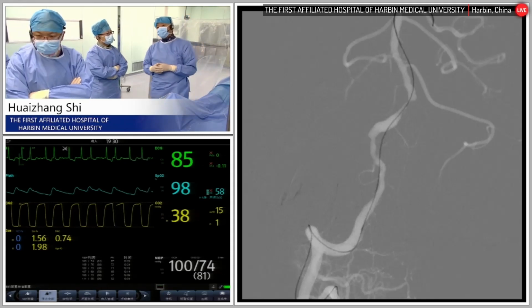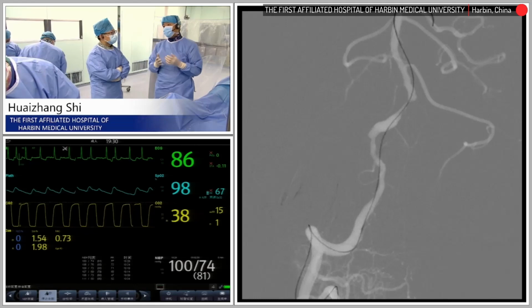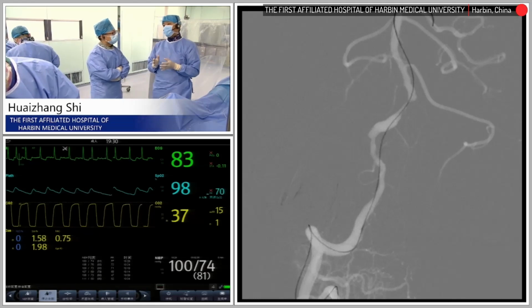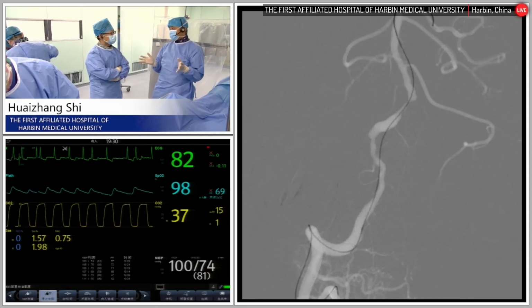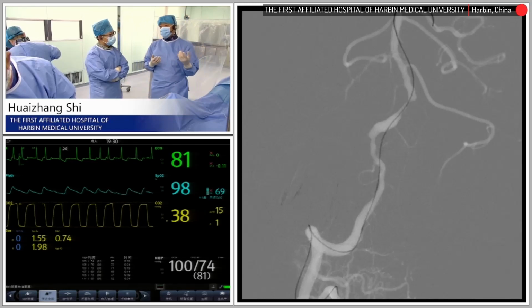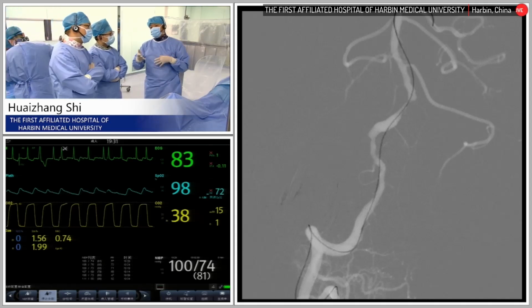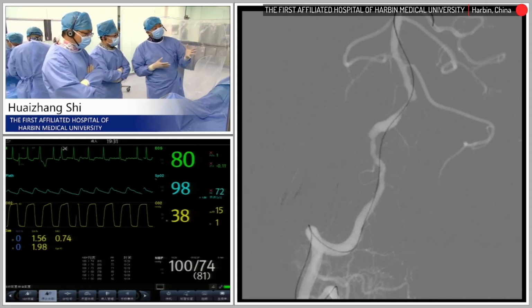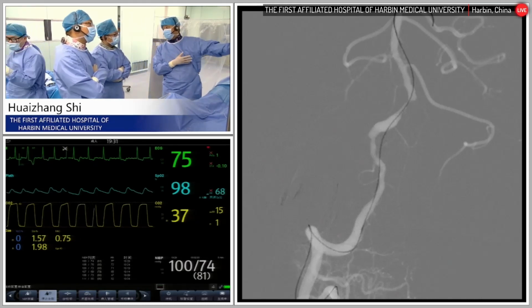For intracranial stenosis stenting, the most dangerous complication is vessel rupture, bleeding. We are very concerned about this complication. So we should use a very soft wire at first, with the microcatheter, and with the wire's assistance we navigate the microcatheter very far.